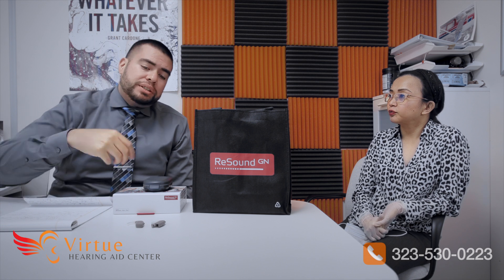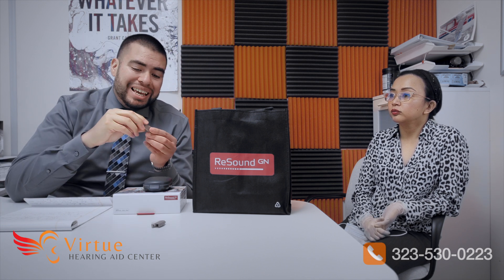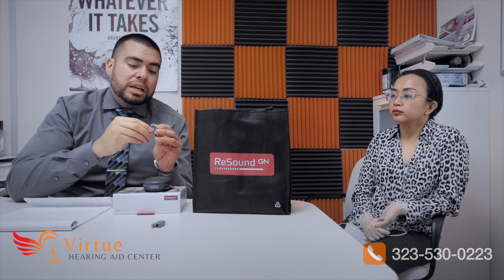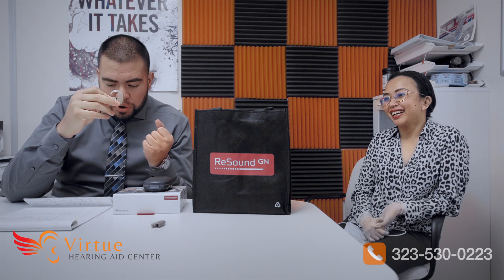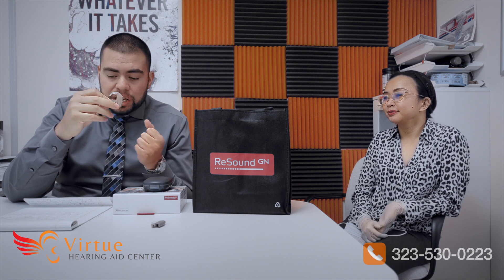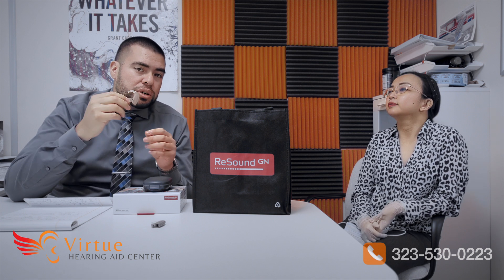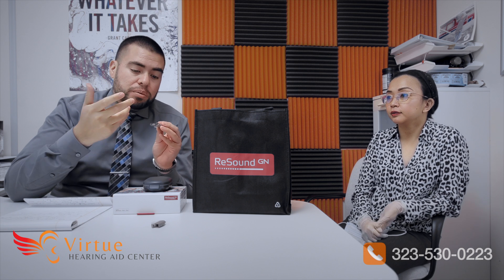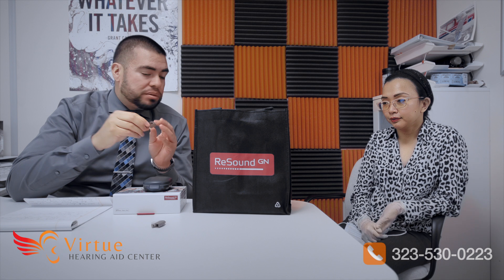This is a battery-operated hearing aid. It uses a 675 battery, which is the biggest hearing aid battery available. If you use it on average about 15 hours a day, it's estimated you get almost two weeks of usage with each battery — better than most hearing aids.